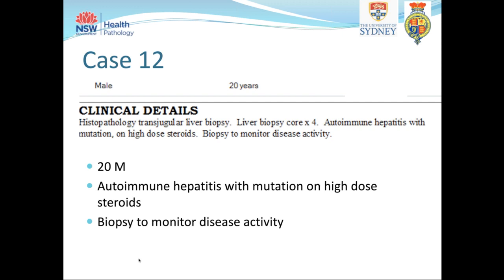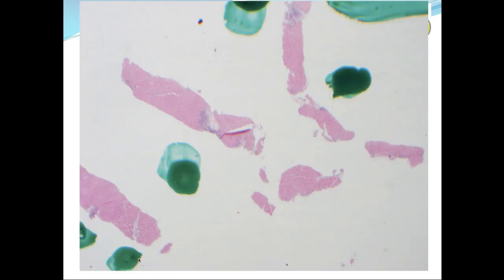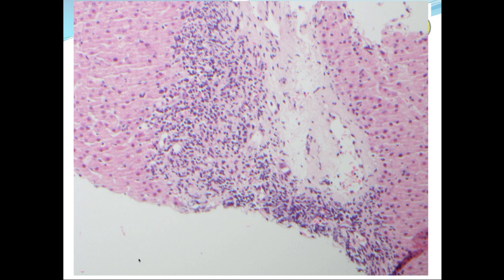So two more quick cases. This case was sent, a 20-year-old man, autoimmune hepatitis with mutation, biopsy to monitor disease activity. So these are the biopsies here, transjugular biopsies, which tend to look a bit fragmented.